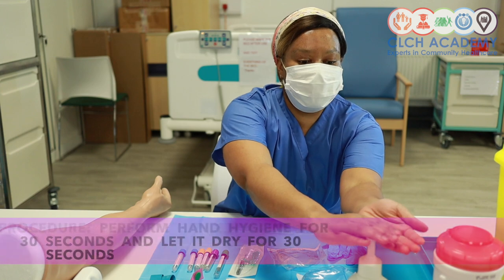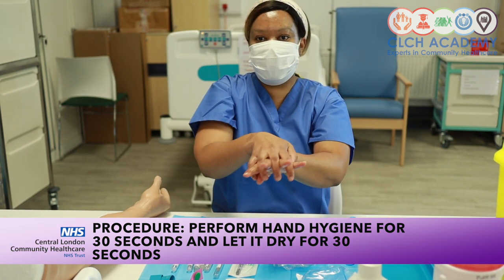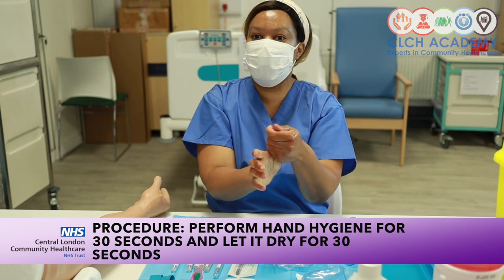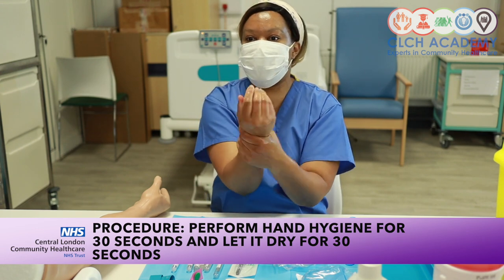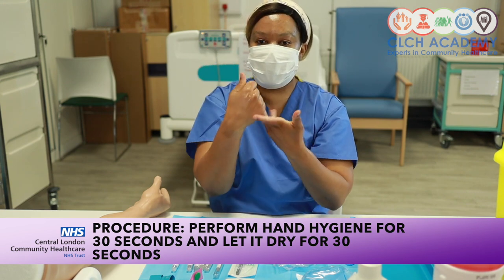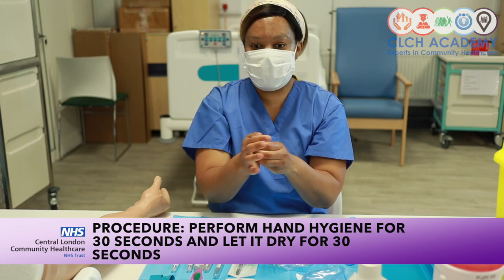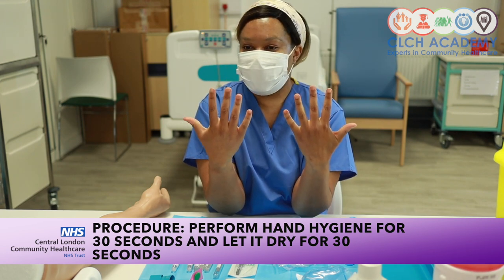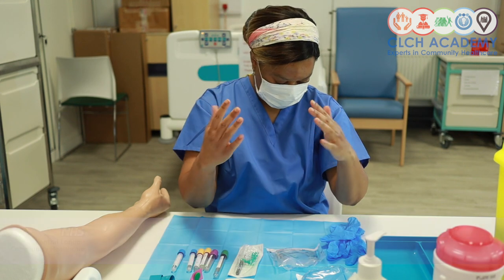So first and foremost, I will decontaminate my hands. Again, palm to palm, interlocking the fingers. And I'm sure you're all familiar with good hand washing technique, taking into consideration the wrists, bare below the elbows, the fingers. But we've already covered all of those bits, the nails, making sure you wait until your hands are nice and dry. The killing action of the bacteria happens when your hands are dry. So don't leave them wet.